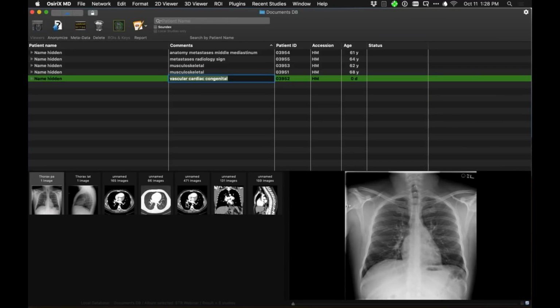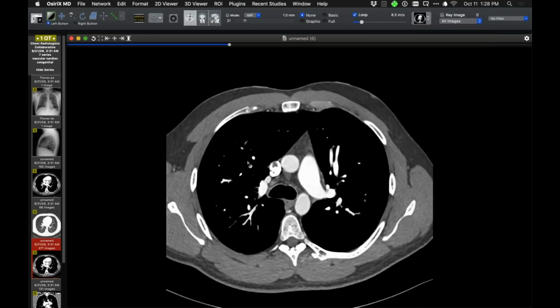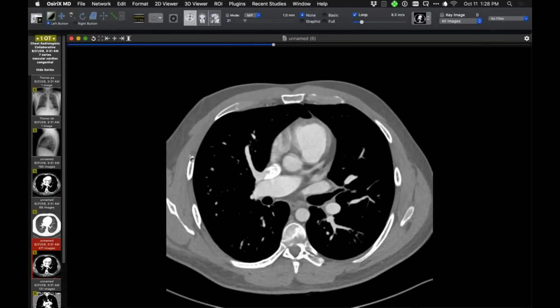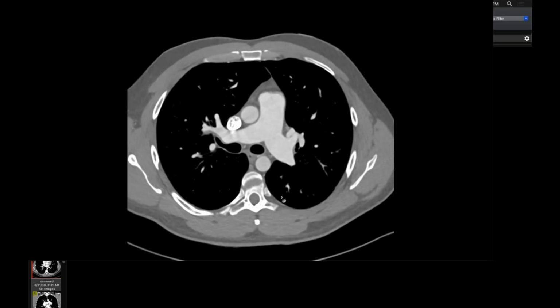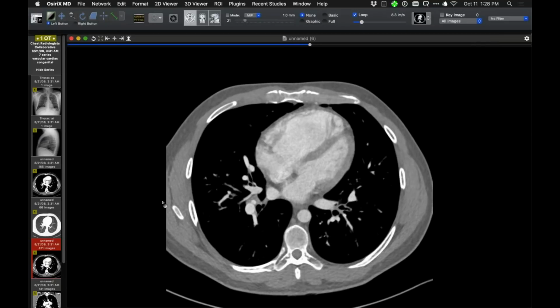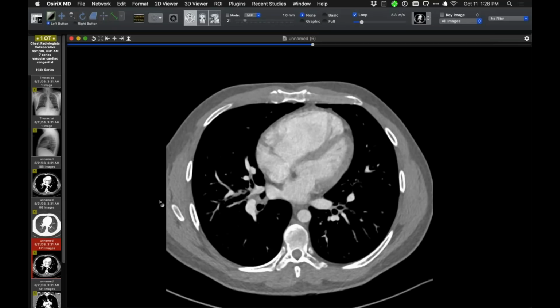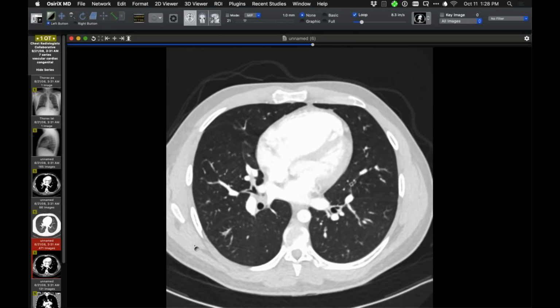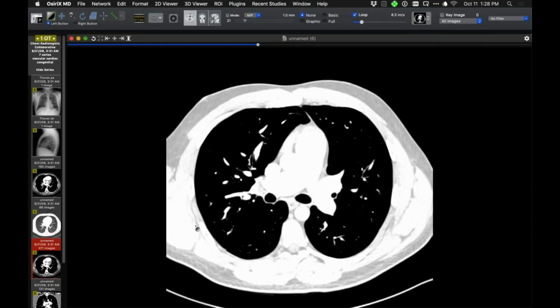This patient had imaging for a CTPA for acute pulmonary embolism, and no pulmonary embolism is present. But findings that are present were not recognized. So some salient findings are, if you look at the caliber of the main, but also the left and right pulmonary arteries, together with the enlarged right cardiac chambers, rather quite big, one should think something's going on. And certainly pulmonary hypertension is a consideration. And certainly if you just look at the lungs, we don't have lung disease that could account for that. We don't have acute pulmonary embolism or pulmonary thromboembolism that might account for pulmonary hypertension.